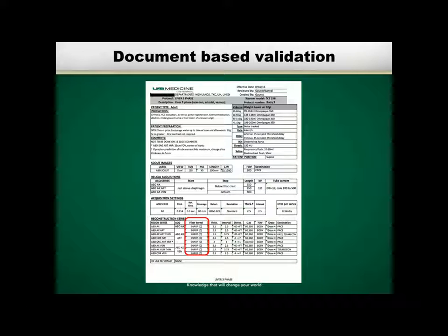Identify the precise image kernel. Don't just say this should be a bone or a soft tissue, because the names of those filter kernels change from one model to another, and certainly from one vendor to another. Which raises the last point: this protocol document is model specific. A lot of this information is going to be different from one model to another. Even the structure of the form will be different from one model to another.